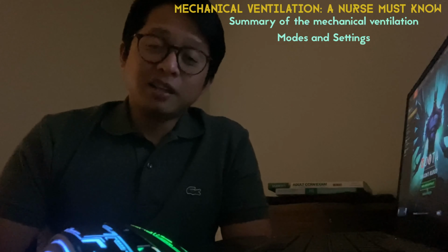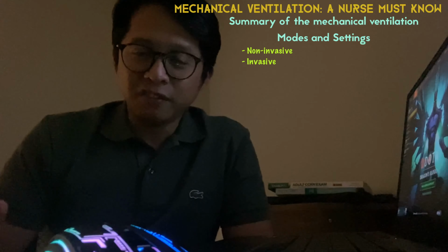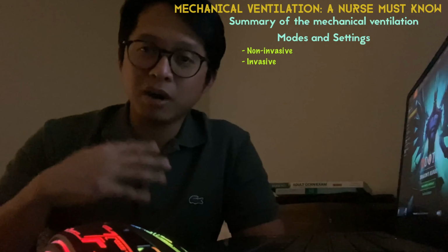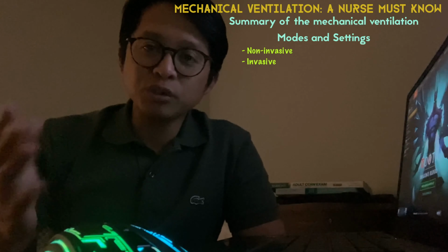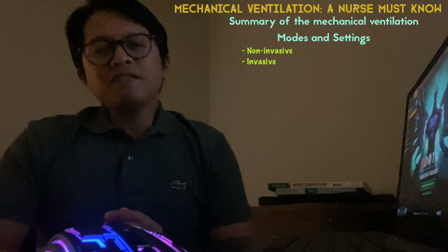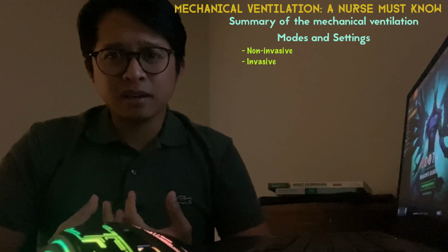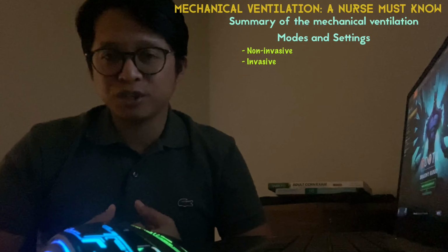Mechanical ventilation can be non-invasive or invasive. It is termed invasive if it involves any instrument inside your trachea through the mouth, such as the ET tube or the endotracheal tube, and through the skin, such as a tracheostomy tube. In non-invasive mechanical ventilation, we use a face mask, nasal cannula, and a bag valve mask on appropriately selected conscious patients.